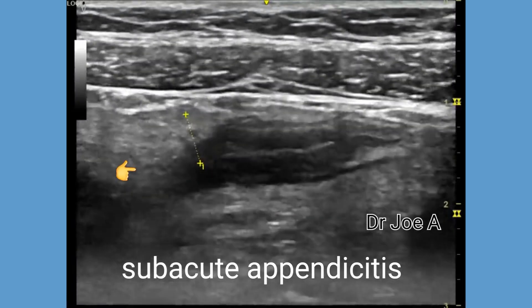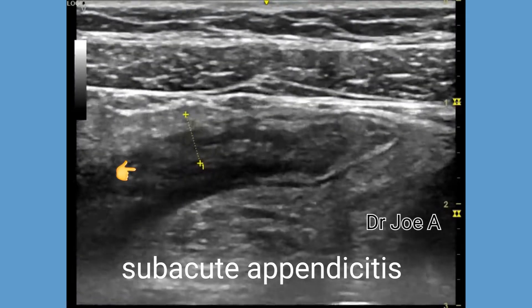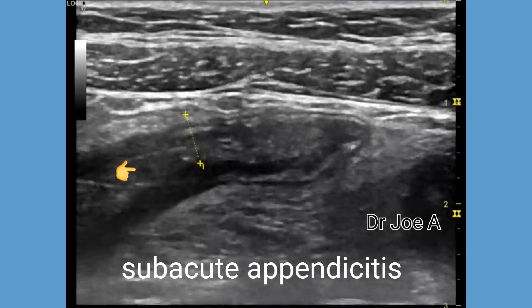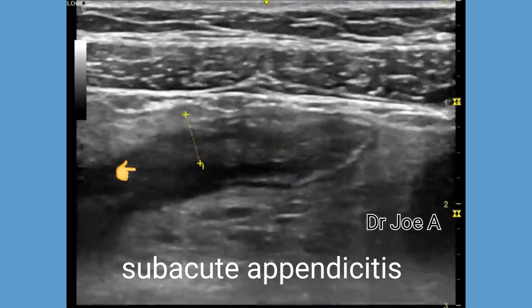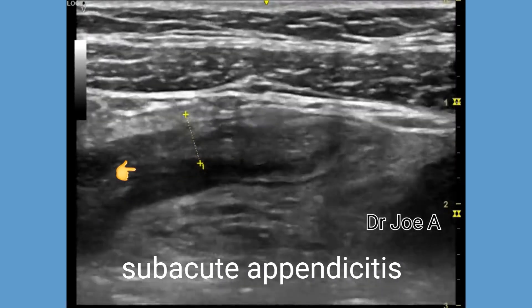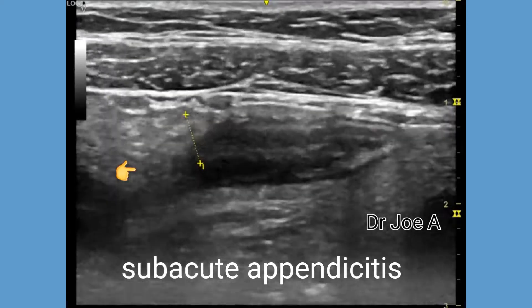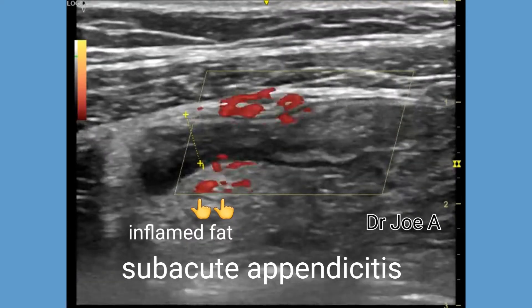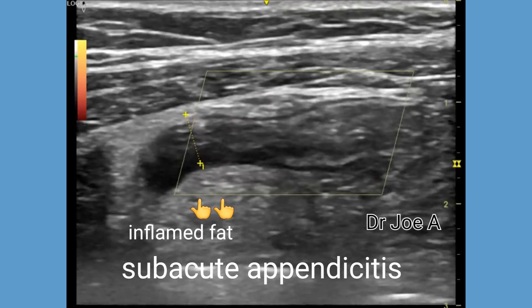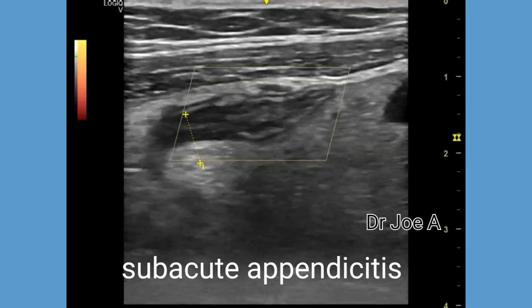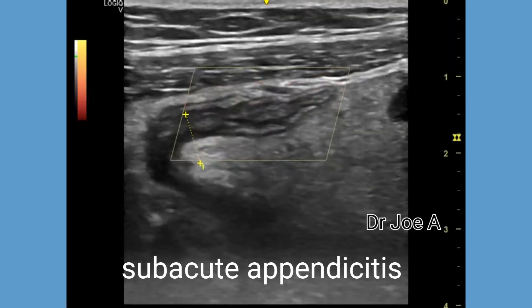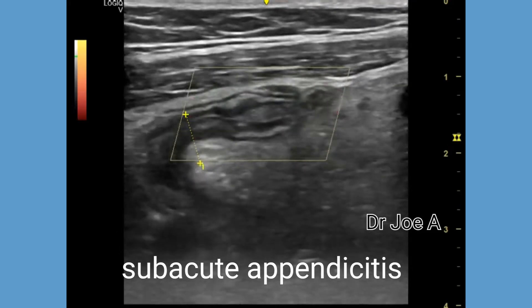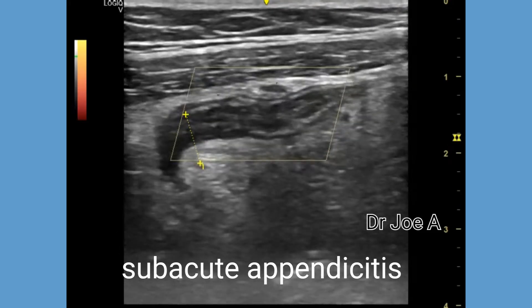This is a case of sub-acute appendicitis in a child. The appendix appears swollen and edematous with a diameter of more than 5 mm. Power Doppler shows minimal increase in vascularity, which further confirms the sub-acute nature of the appendicitis.